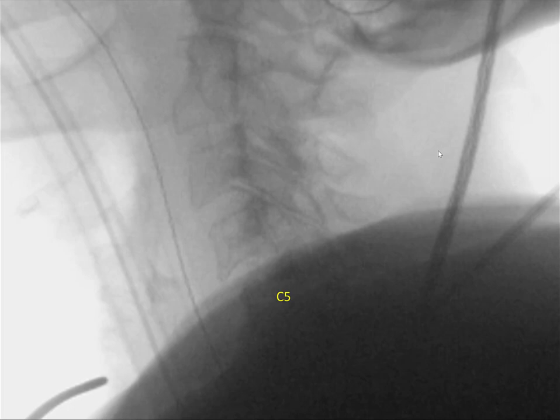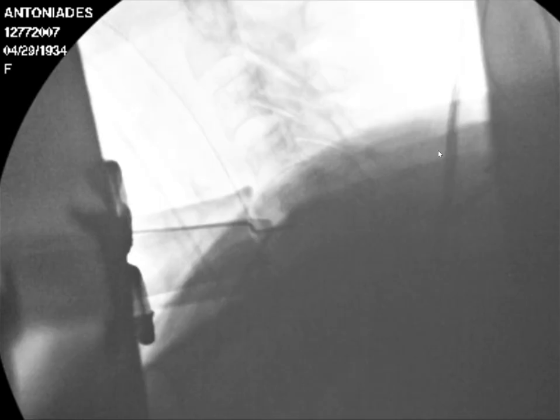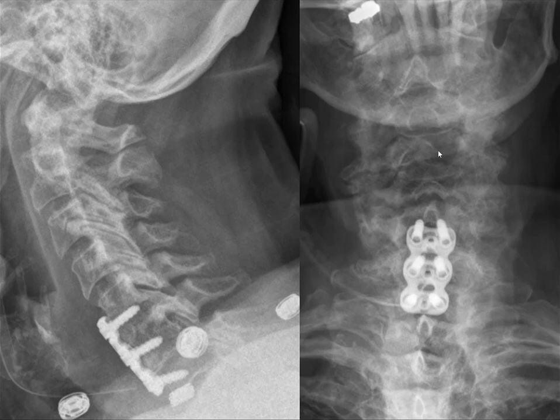So this is just back to our case, C5-7 ACDF. We flexed the neck slightly, the neuromonitoring improved, and we went forwards with a C5-C7 ACDF. And these are the post-op x-rays 1 month out. The patient woke up completely fine, symptoms completely better. And you can see, interestingly, that the C4-C5 spondylolisthesis is not present, and the patient can hold her head up better than pre-op, probably because her stenosis and her painful problem has now been fixed surgically. The patient did very well post-op.